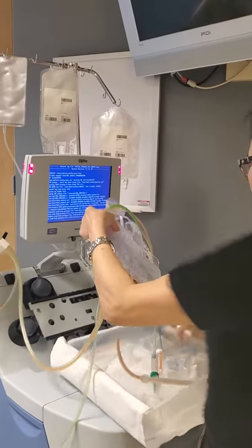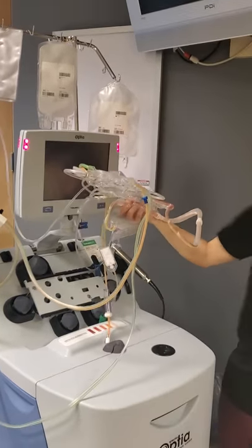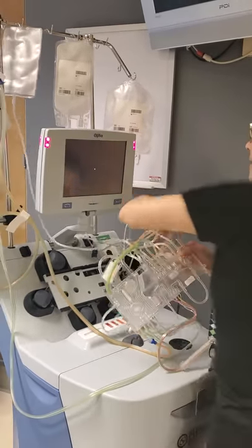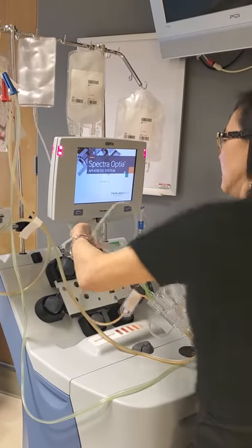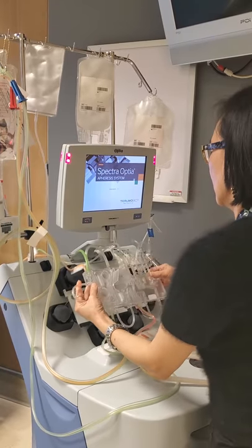You want to take your spikes out first. That runs straight over here. Orange is AC, green is saline.